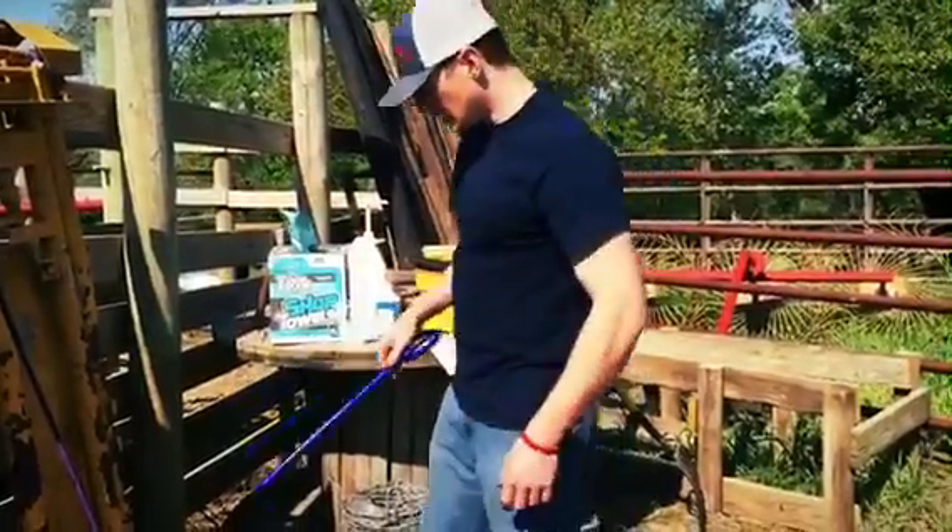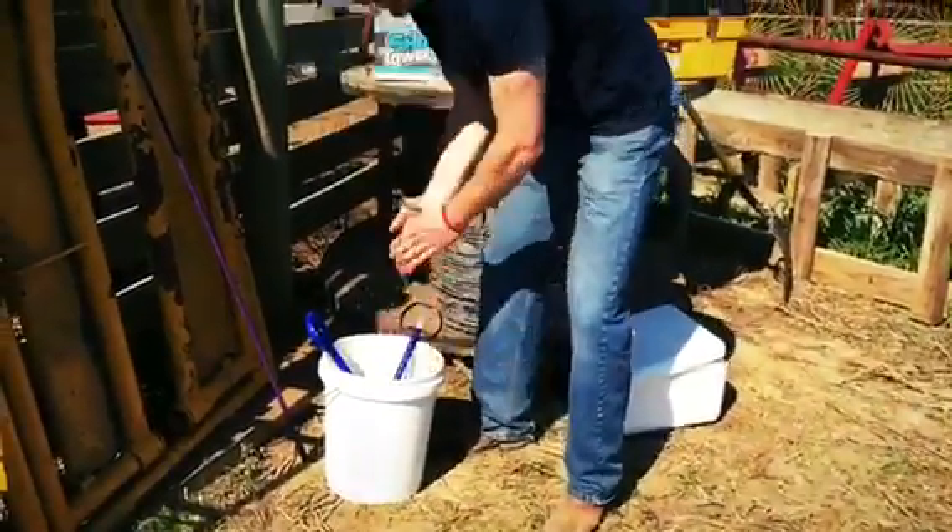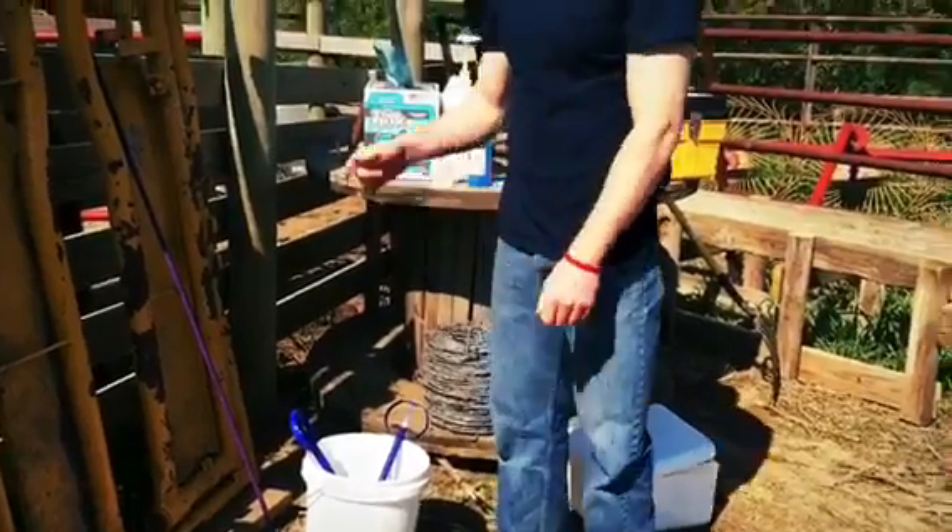After you're done inserting, put the applicator back into your bucket of disinfectant, and then you're ready for the next one.